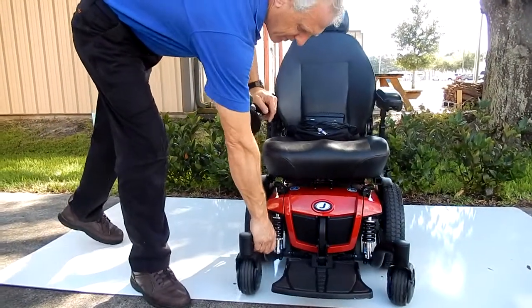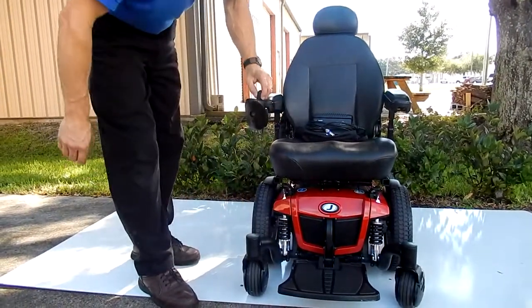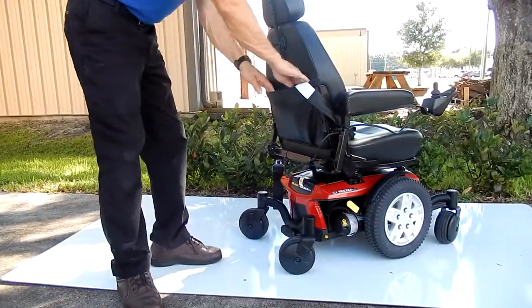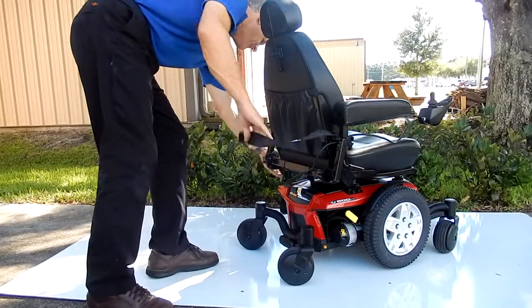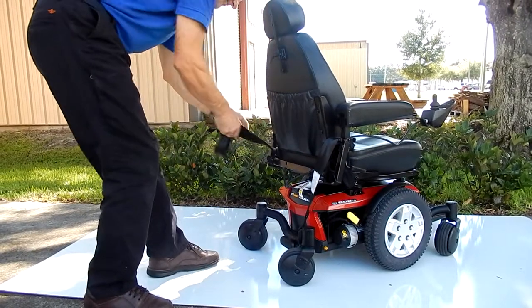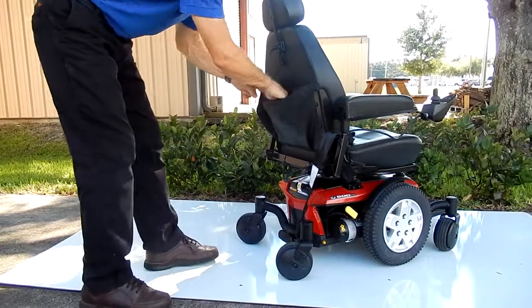You can see the suspension in front of the chair. Also on this chair in the back, you have a pouch and a safety belt, which we usually keep stored in the back here all the time.